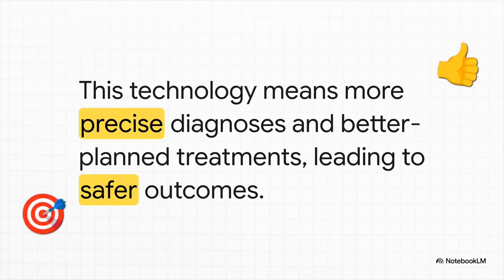And at the end of the day, what does all this tech mean for you, the patient? Well, it means your dentist can make a much more accurate diagnosis. It means your treatment is planned out way better. And it means fewer surprises when you're in the chair. It all adds up to safer procedures and, honestly, just better results.